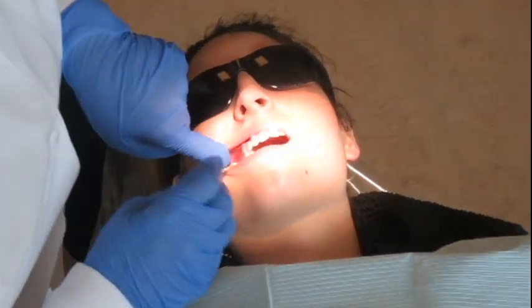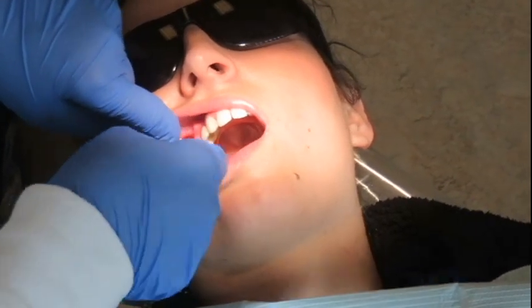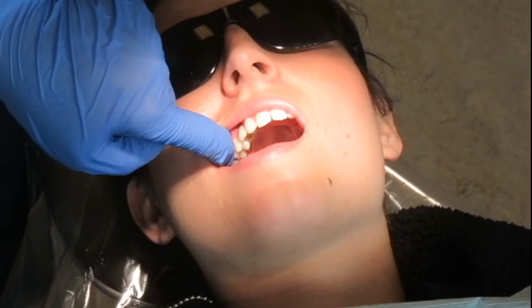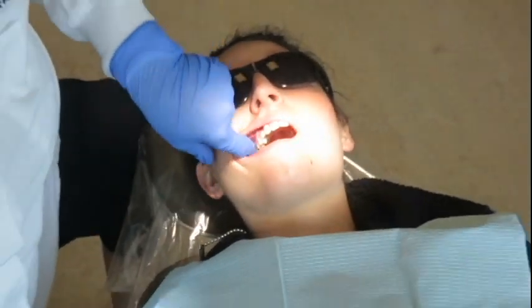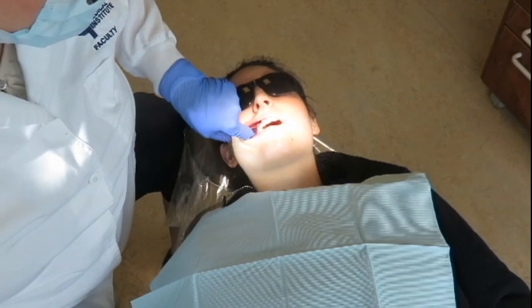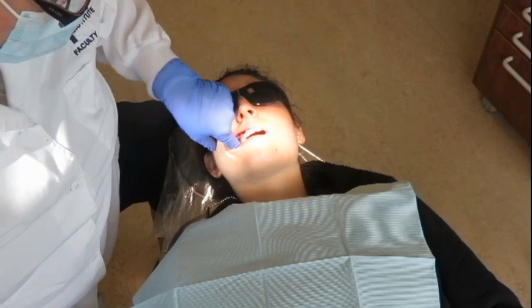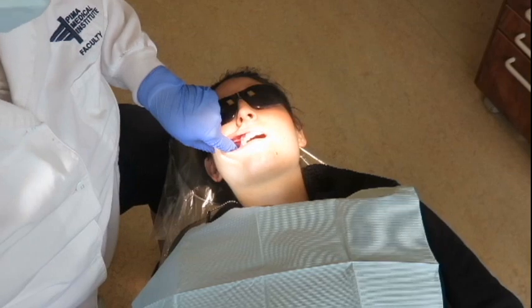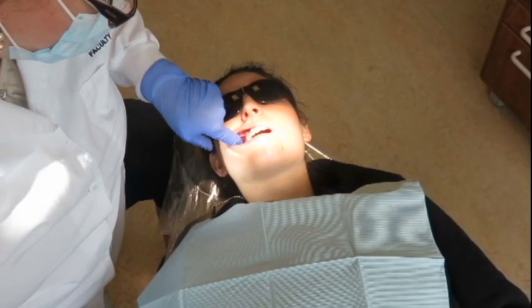We've had the topical sitting on there, so I'm going to wipe it off and we'll be ready to go. You want your patient's face parallel to the floor. I like to tell my patient, 'I'm going to be tugging on your cheek,' because when they feel you pulling, they'll want to turn their head towards you and you'll lose your angle. So I say, 'I want you to resist me — I'm going to be tugging on you, but you stay where you're at.'